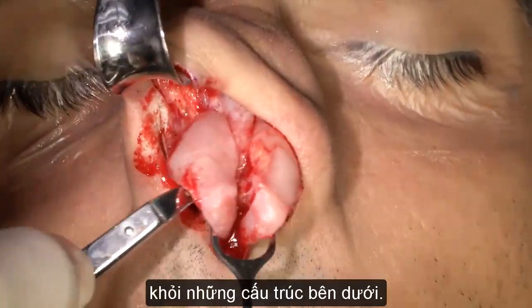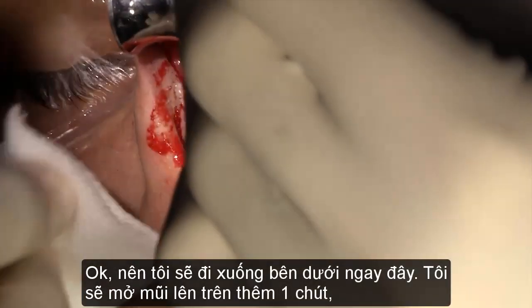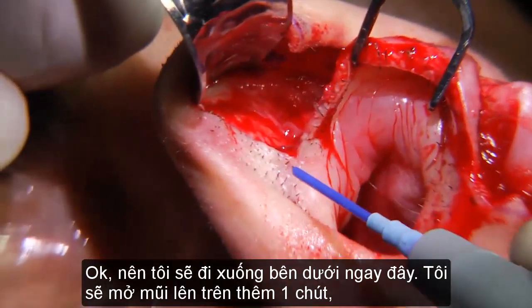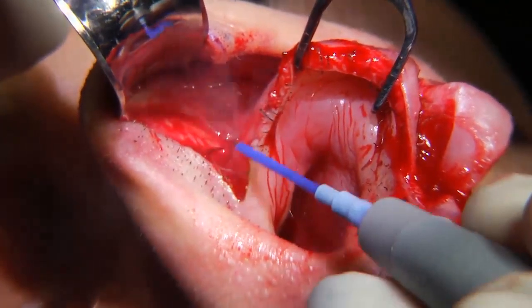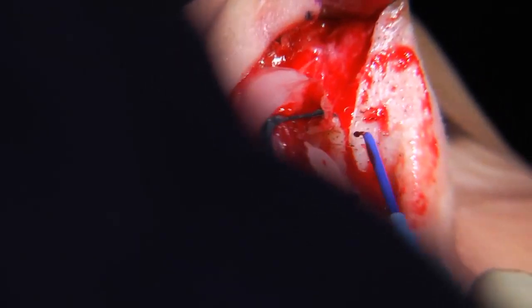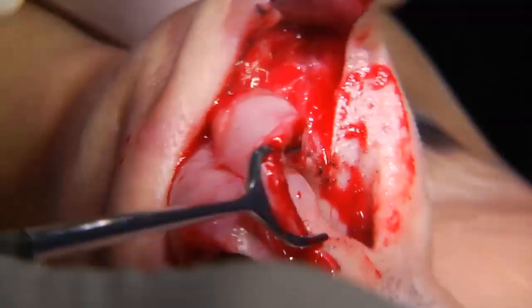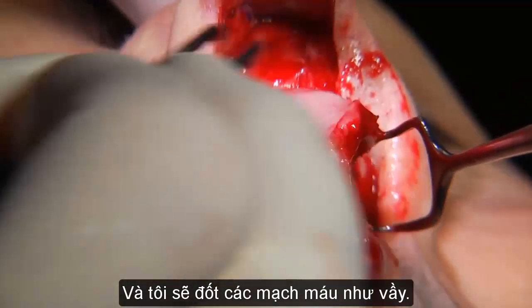Pull up like that. Come on, with the hook. Okay? So I go down here. I will just open this up. Another tiny bit. I'll do the same on this side, and I will lower it a little.